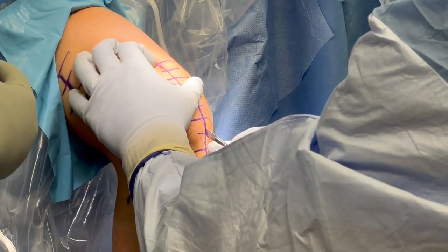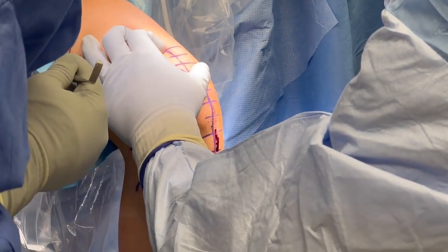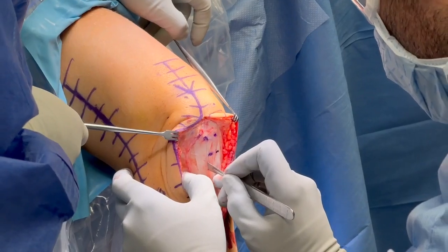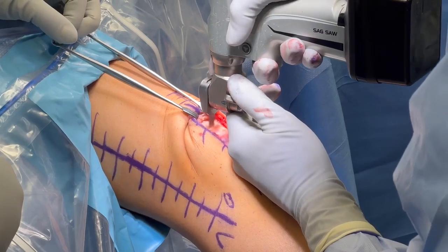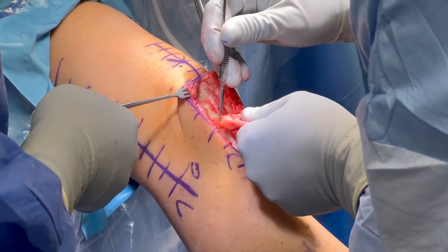The graft harvest is performed first, beginning with an incision from the medial patella distally to the tibial tubercle. The central third of the patellar tendon is harvested with a 10 by 20 millimeter bone plug off the patella and a 10 by 25 millimeter bone plug off the tibial tubercle.